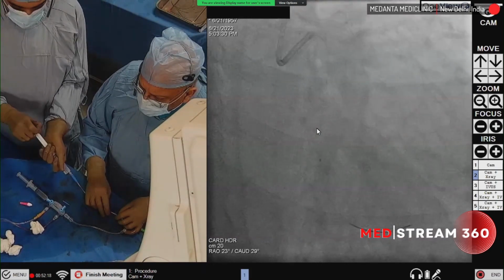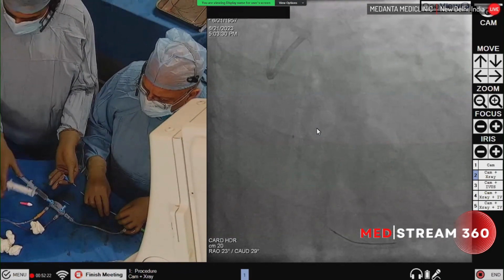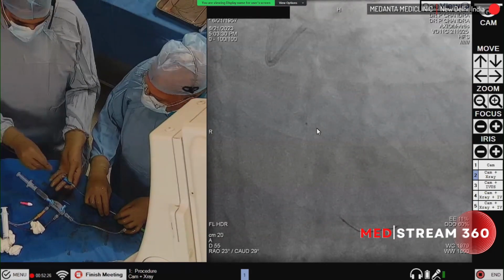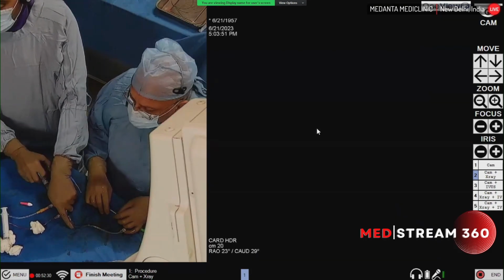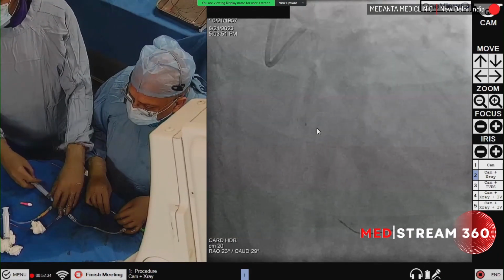Yeah. Okay. So we are on the same wire, which was the FFR wire, and doing the whole intervention on the same wire. Okay. I think we are fine.